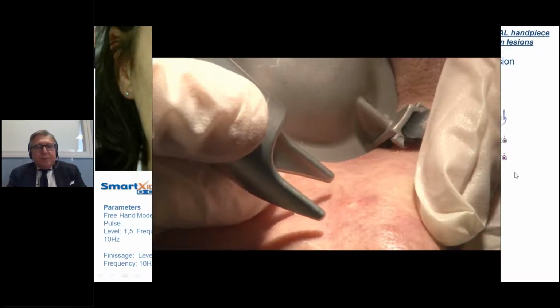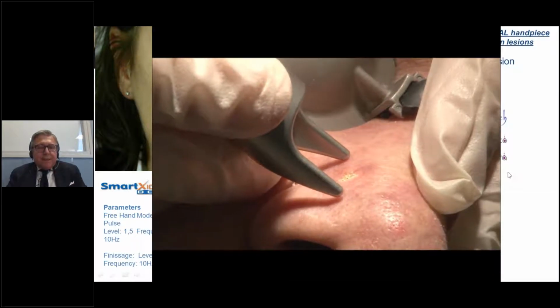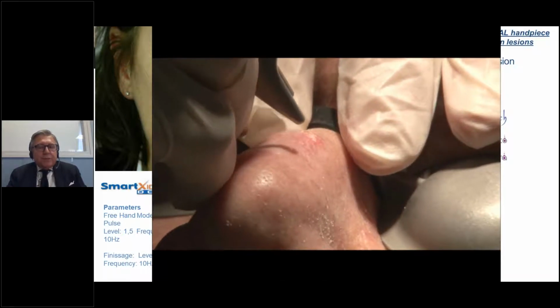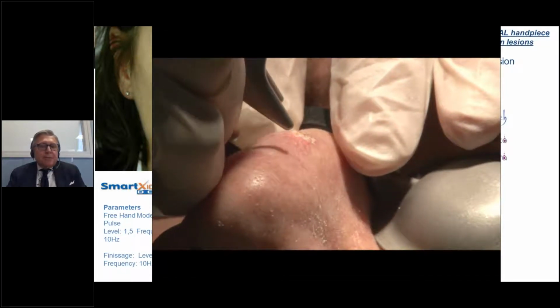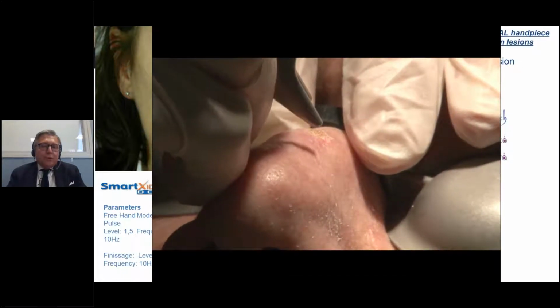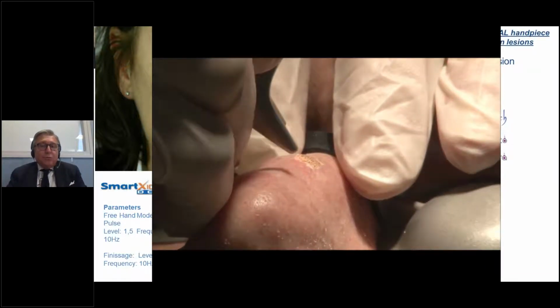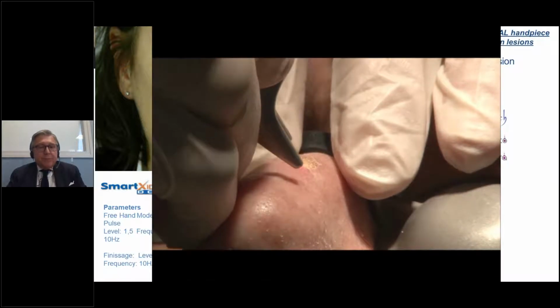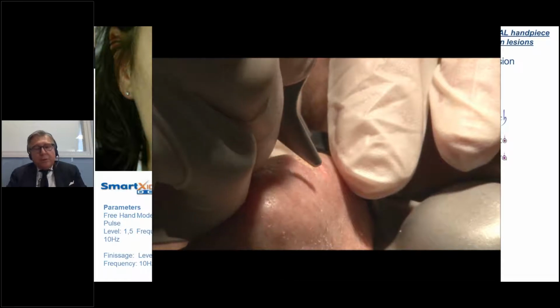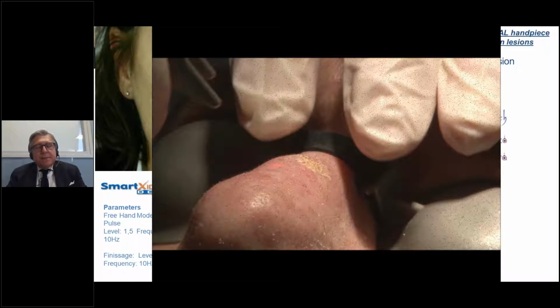This is a video. You can see here the skin that is not terrible with the sun damage, but we have some actinic keratosis and the capability to vaporize in a very superficial way by using SP pulse. We vaporize and we pass 1 time, then we remove the necrotic debris with wet gauzes, which is very important. You see the capability to cover an area where we can see some discoloration with some damage, some hypochromia, and it is not so terrible, but it's definitely sun-damaged skin.